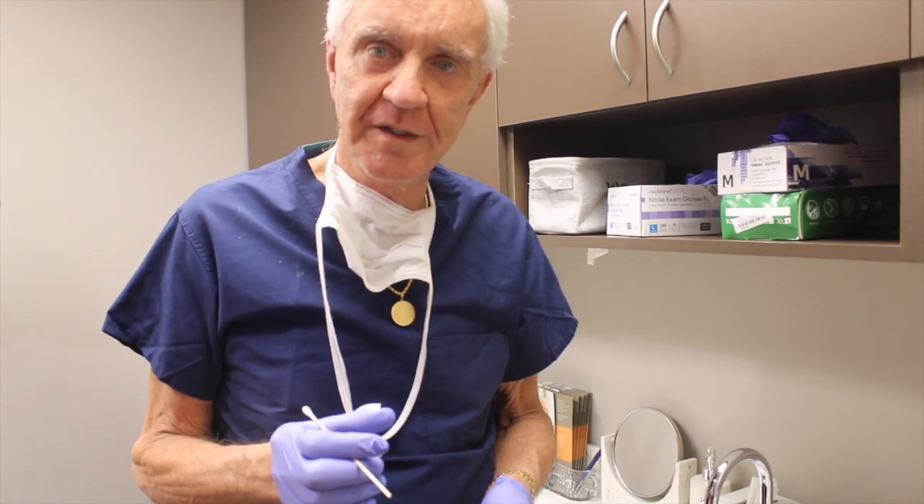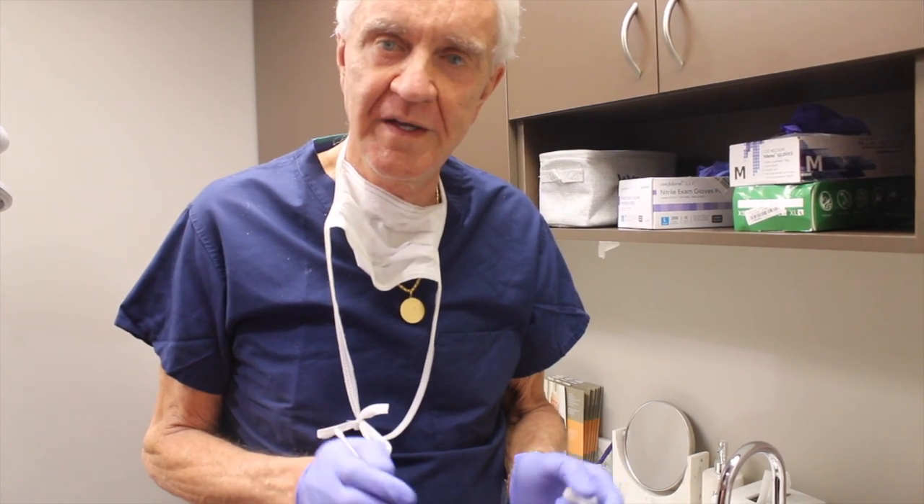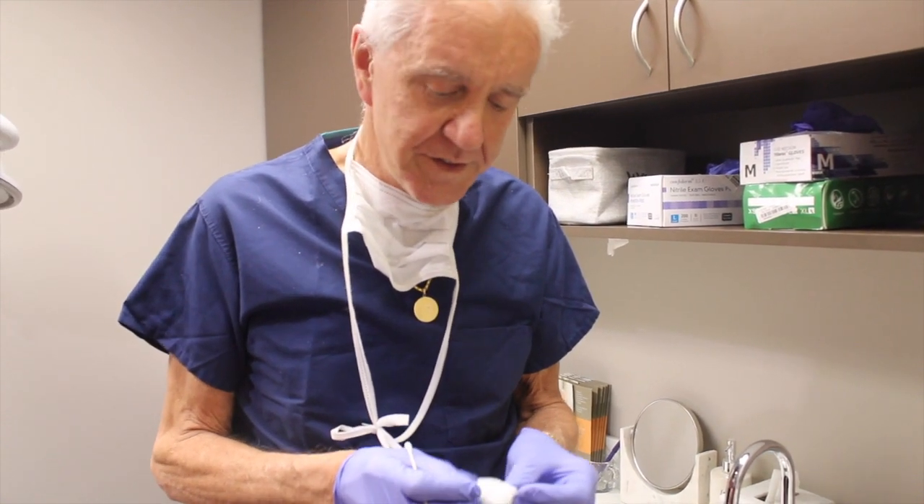When a wound opens up a little bit, it's very tempting to go put a couple of sutures in and close it up. But if you do, you're almost guaranteed to have an infection. If we put a little moist dressing in there and keep changing it, eventually the wound will heal. You won't even see where it opened and you'll never get an infection. This is how you do it.